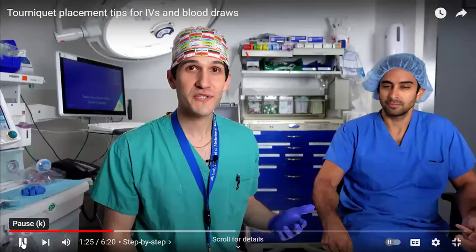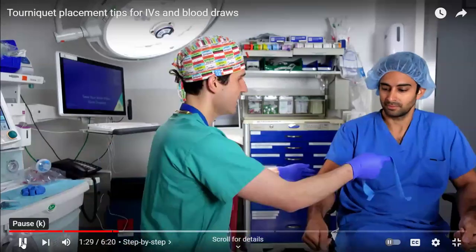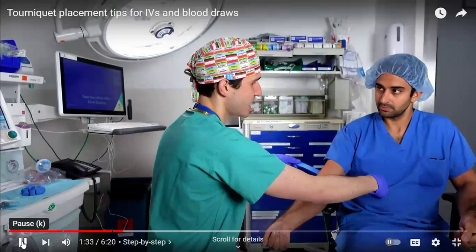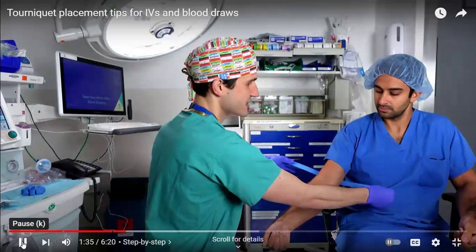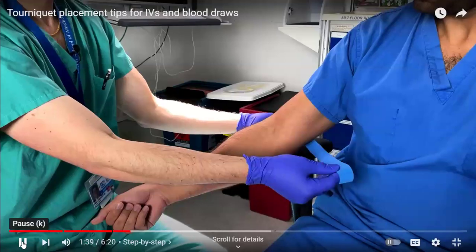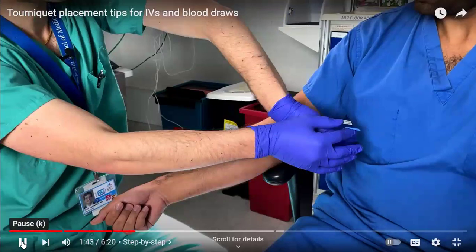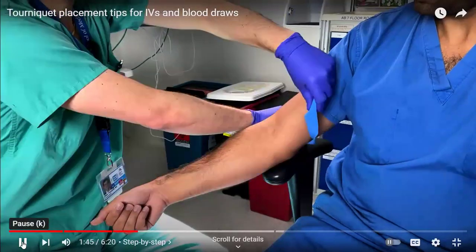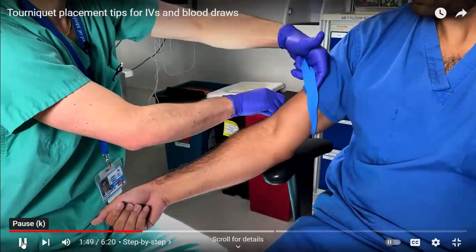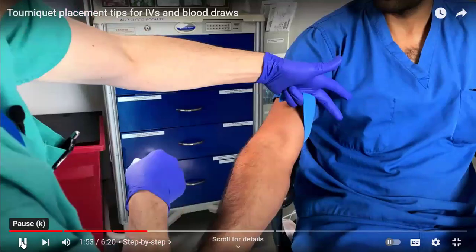With those goals in mind, the way that I start is by placing the rubber band under the patient's arm. In this case we'll be placing the tourniquet on the upper arm, and you can see that it runs just behind his arm like this. With the tourniquet behind the patient's arm, I reach across with my left hand and make this the back side of the tourniquet, and I secure it in my left hand with my fourth and fifth digit, just like this.